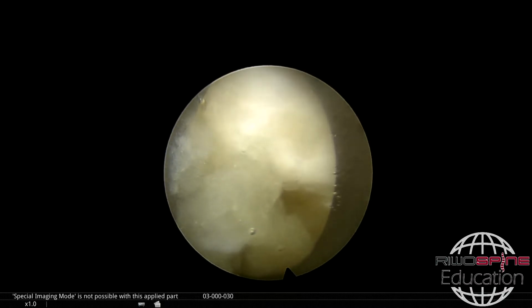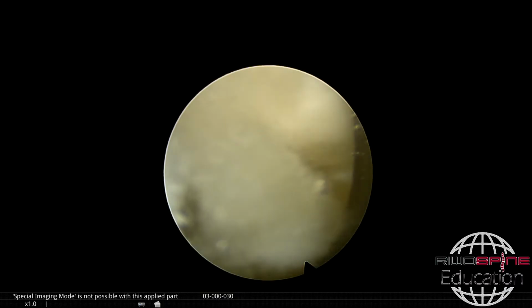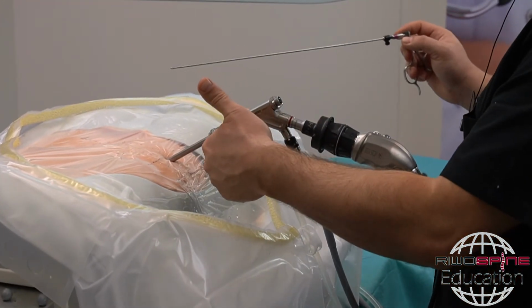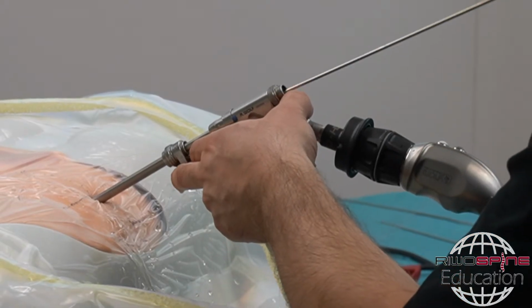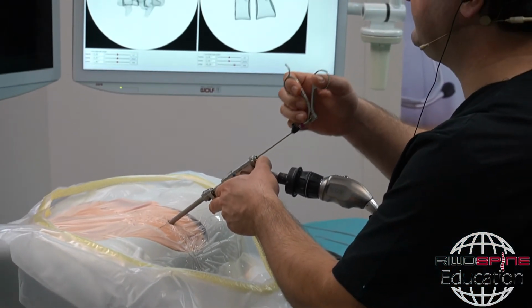Okay, the reason why I place the handle always like this: I put my finger here and keep the endoscope distance easily like that. Okay, now starting the operation like this.